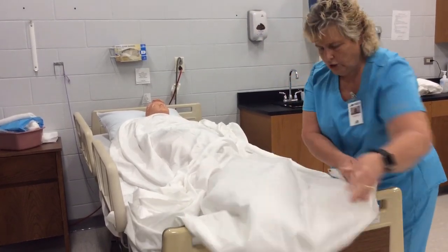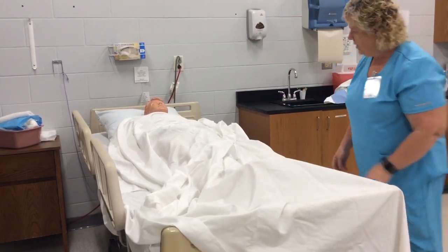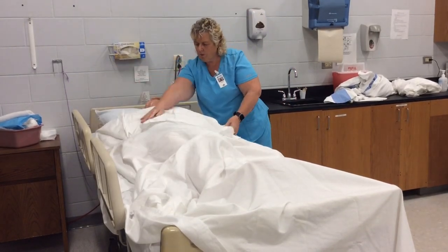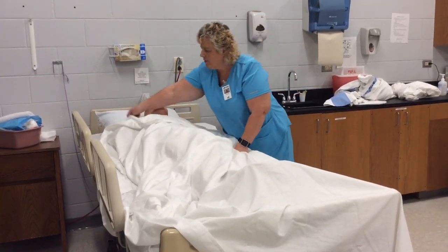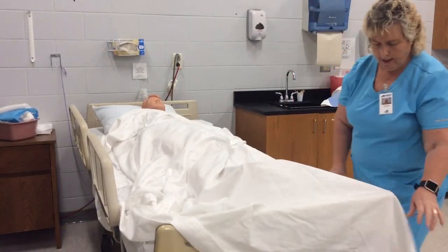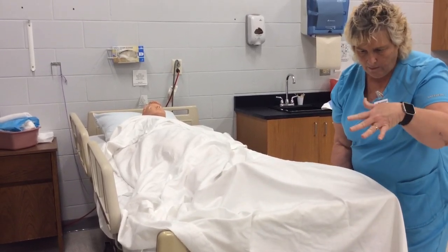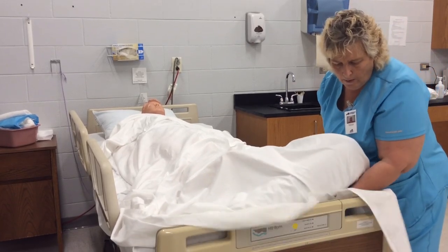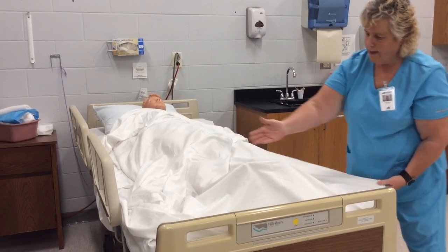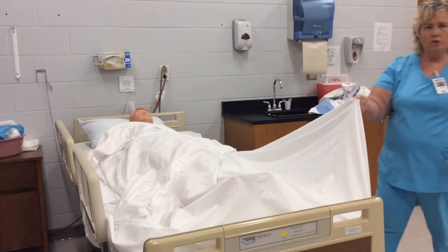Now I want you to take the sheet and lay it over the end of the bed. This is just a good way to learn this. If your sheet is super long, and this one is, I sometimes will fold it over like that so that I won't have a lot of sheet at the bottom. So it's over the end of the bed, and I'm going to lift this bed up just a little bit with my hand, with the palm down, and I'm gonna pull it, and when I get it under, I'll tug it just a little bit, bring it out to the side, find the ankles, and come all the way down here.